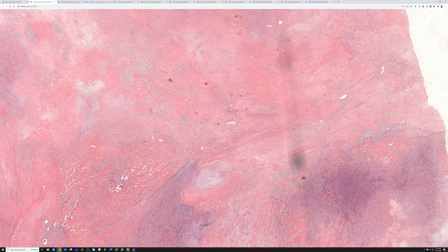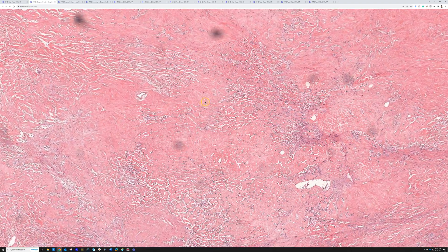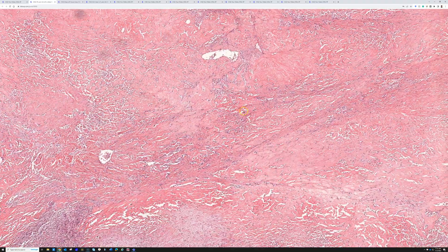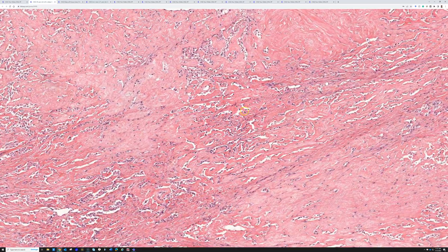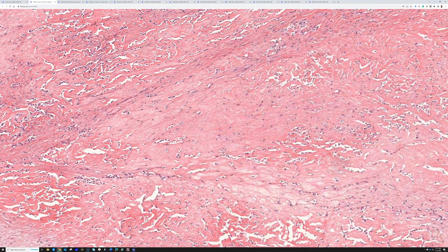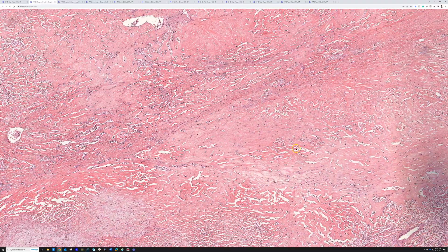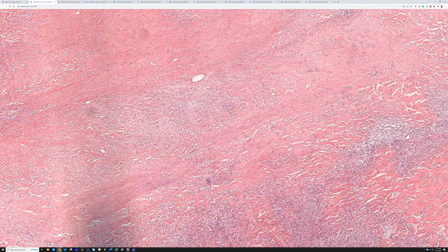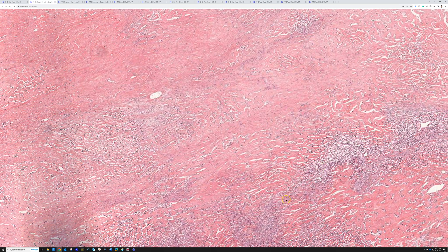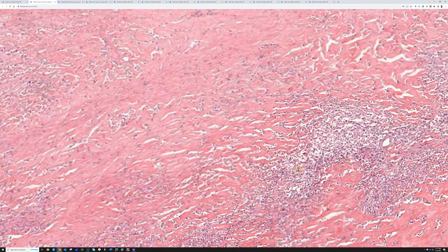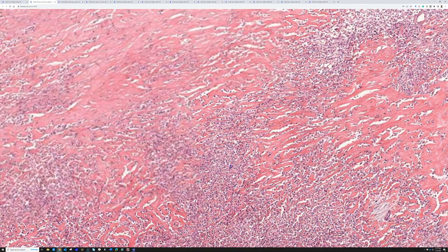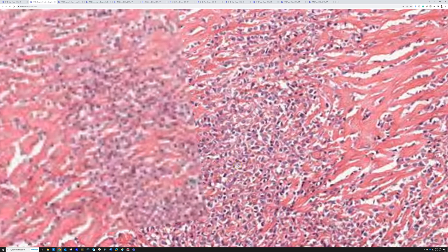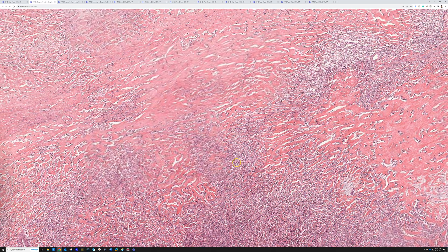The key to the diagnosis here is this area to the right, where we can see dense sclerotic collagen and all these cracks and spaces. At first you might wonder if those are vascular spaces — they are not. They're artifactual clefting and cracking around the tumor cells. The tumor cells have a more round, almost round blue cell appearance here.